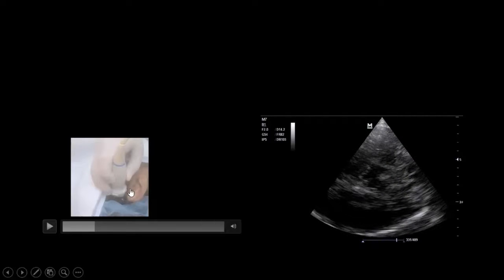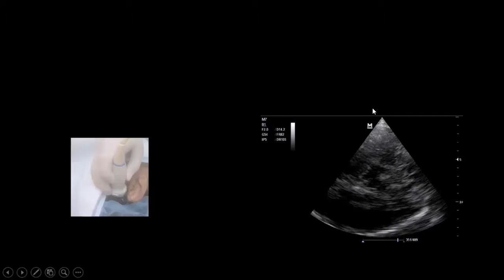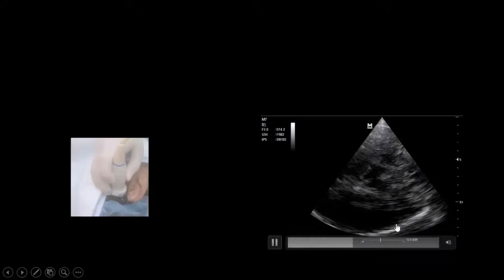The phased array probe is angled 30 degrees from the horizontal to obtain an oblique axial view. On the right side examination, the mark on the phased array probe is placed posteriorly — here is posterior, anterior, lateral temporal, and medial. You will cut an oblique axial view of the brain and concentrate on the center to see the butterfly or Mickey Mouse appearance, which is the midbrain. Around it you will find all the basal cerebral arteries: posterior cerebral artery, middle cerebral artery going medial to lateral, and anterior cerebral artery going lateral to medial.